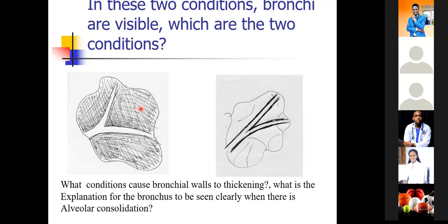So it means the bronchi and the bronchioles are still containing air. Okay, so on our image, this white tube here is the one which is looking black, and these alveolar spaces here, because there's already fluid in, or any other soft tissue, are already looking gray.